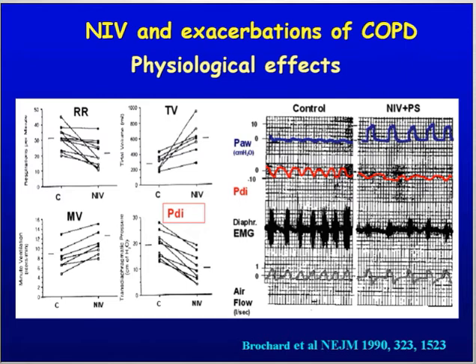And therefore, you need to have something to stop this vicious circle, which will lead to either respiratory arrest or need for immediate endotracheal intubation. And this is what can be offered by non-invasive ventilation.